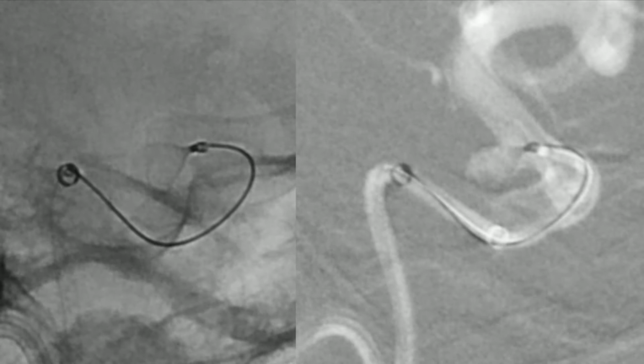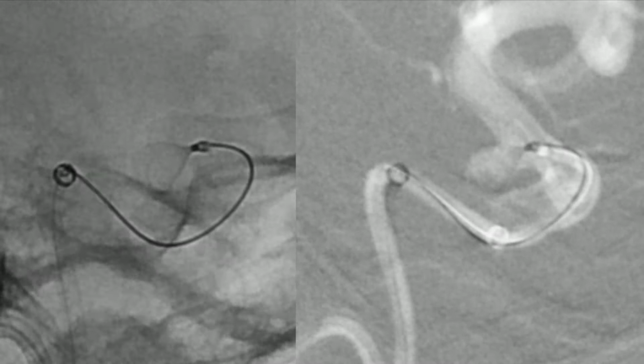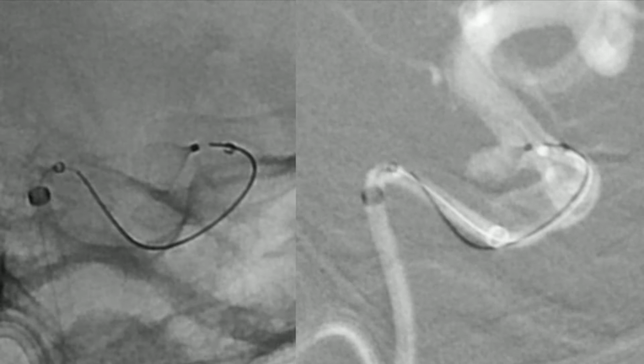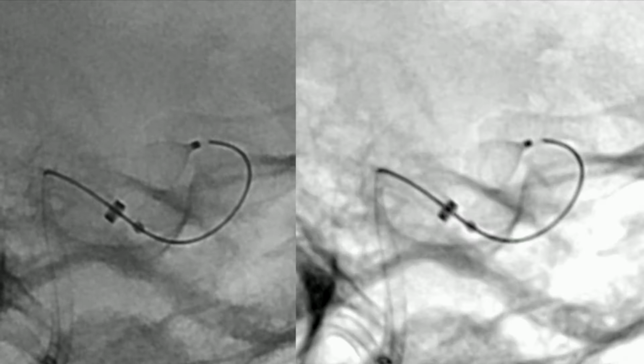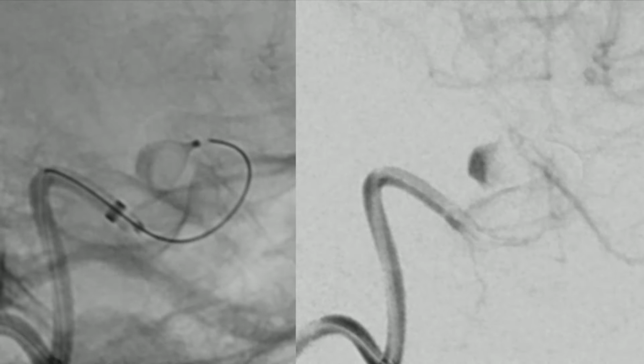And now we can manipulate the microcatheter a little bit. We pull it a little bit back carefully, and that's how we can place the contour device exactly at the neck of the aneurysm, and we can pull back the microcatheter, and now we are satisfied with the positioning of the contour device, and we can perform a 2D angiogram to prove the right positioning of the contour device.